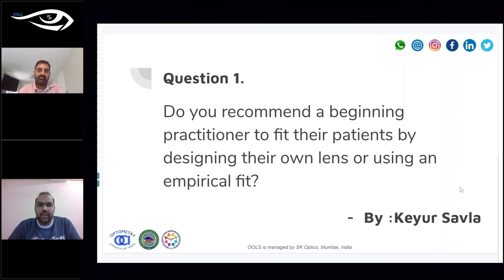Yeah. So as a beginner, you still advise people to do a trial fit and then learn along the way. Yeah. Because what you're not understanding is that software requires a lot more knowledge, training and knowledge, like the lens layers and all this, what you can see. But when somebody's helping you, you start seeing the mistakes that happen along the way. That's right. Much easier. But the long-term view should be, yes, with the software.